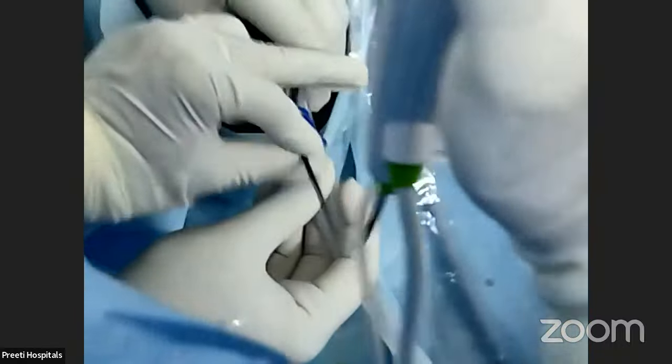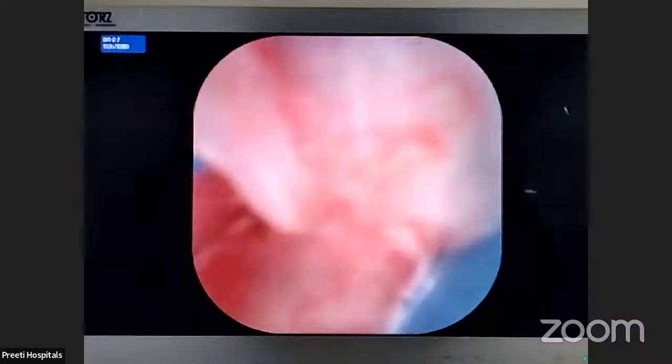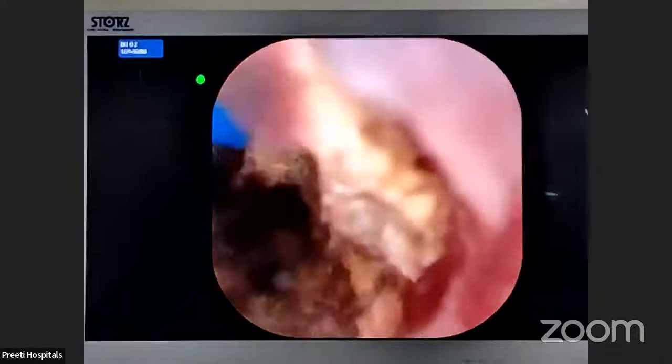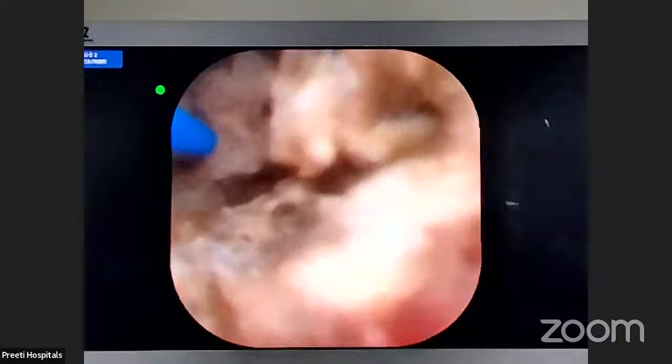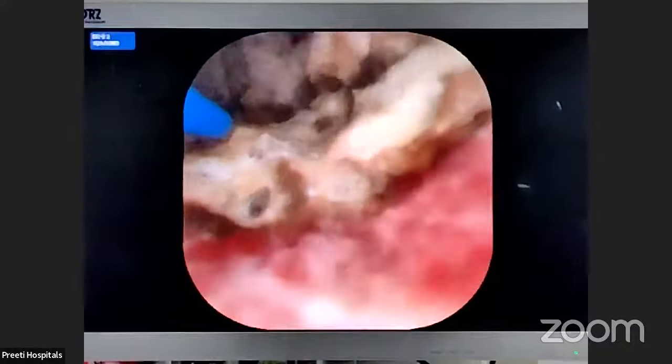You have to understand. Sometimes the calyx may not be seen with a rigid ureteroscope. Just because in this case you are seeing, you should not say that. Once I am inside, don't suck. See, suction is very powerful. So you should be careful when you are activating.